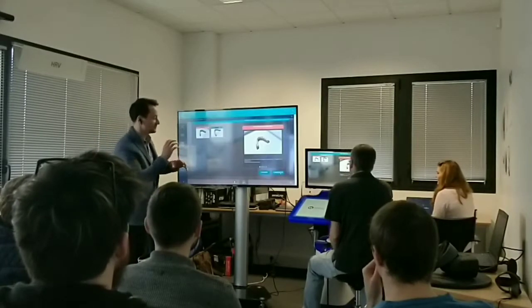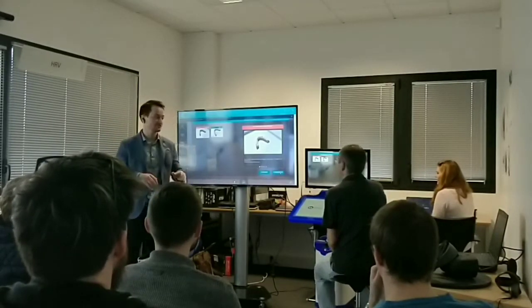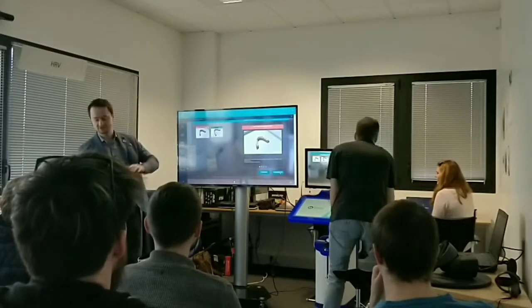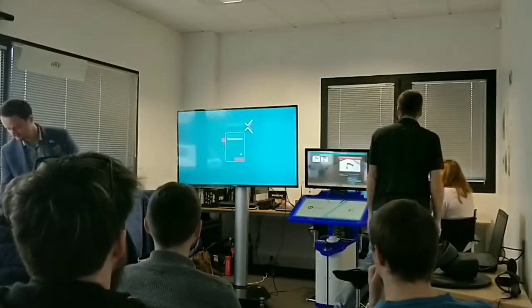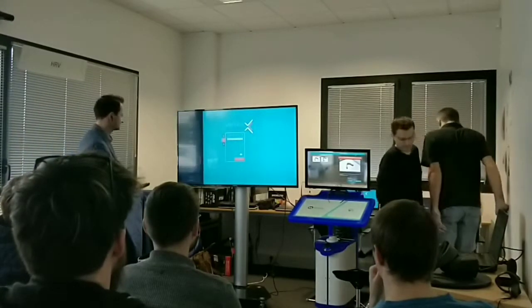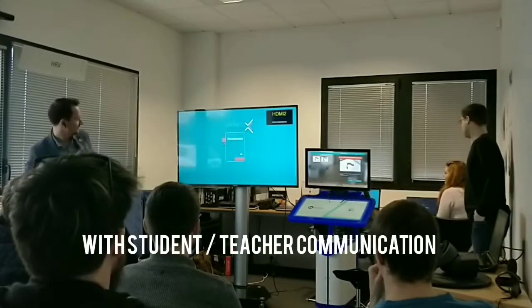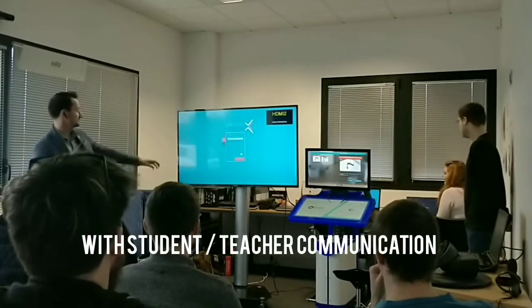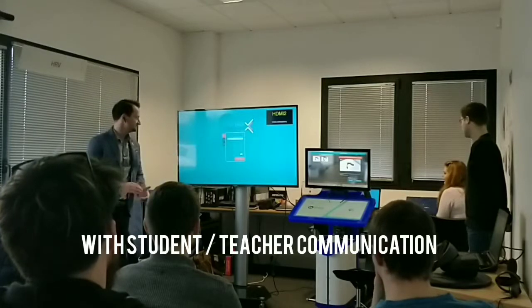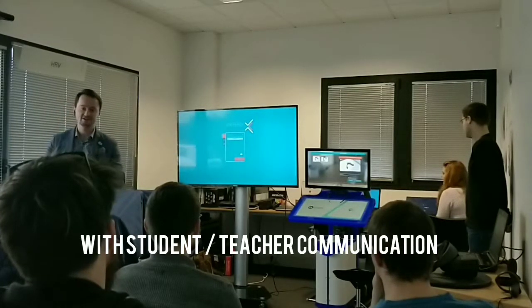Student workflow on the simulator, and within our simulation suite, the student can then go over to the administration PC, and they have a login specifically for students, so they can find their login and log in to see only their evaluations.